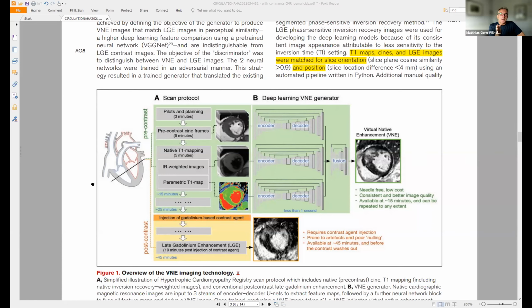There's one from Venkatesh about the T2 map, and I guess that would probably be helpful in the differentiation of acute versus chronic. I think that would be interesting too. And then the question I also would have had at the end is, is this model somehow available for others?